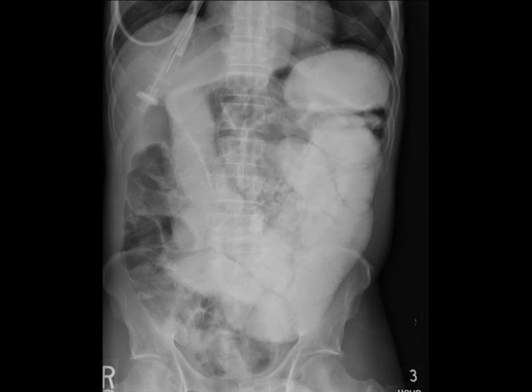For this particular patient, a small bowel obstruction was suspected, not only because the contrast wasn't able to move through the bowel to the terminal ileum, but because of the abdominal and small bowel distension. The patient's small bowel circumference was much larger than normal.